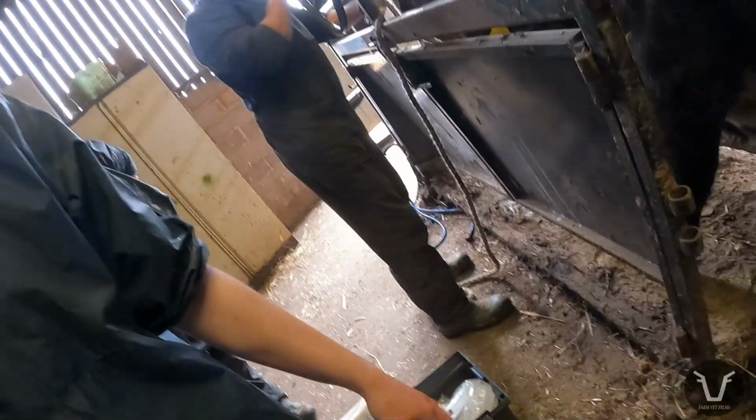Today, our new vet Claire is taking a mass off the side of a bullock. Initially, this was assumed to be an abscess, but as you might be able to see, it's a lot firmer and stands a lot prouder than you would expect. And when you pop a needle in it, no pus comes out, it's very firm. And somewhat ominously, it's growing.